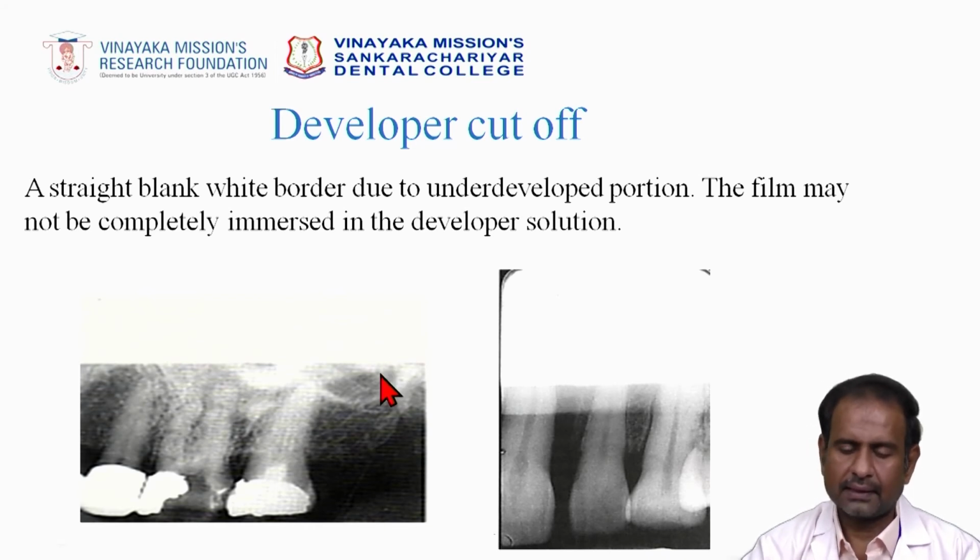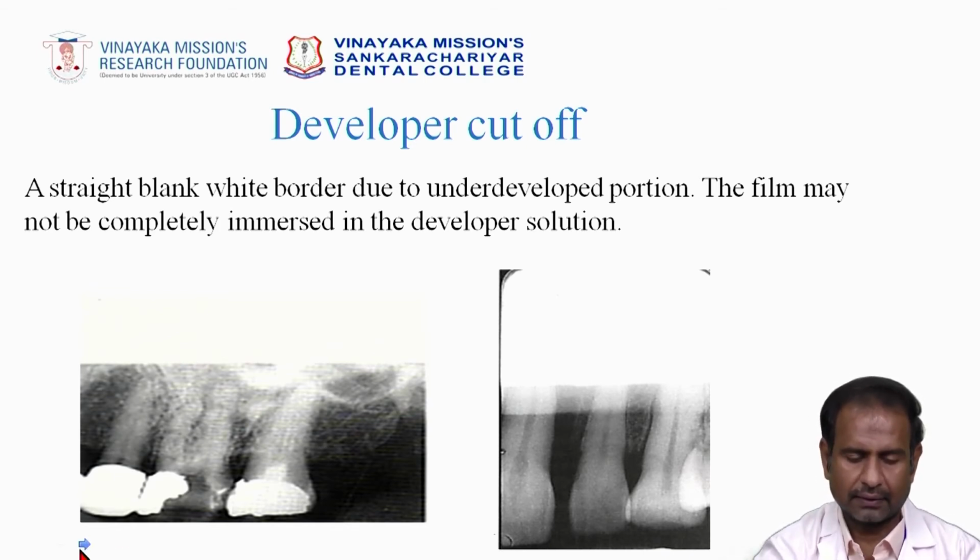You have to remember this is not a cone cut. The developer cutoff is a straight white line. The cone cut is a curved white line. So that's the difference. You should remember that.